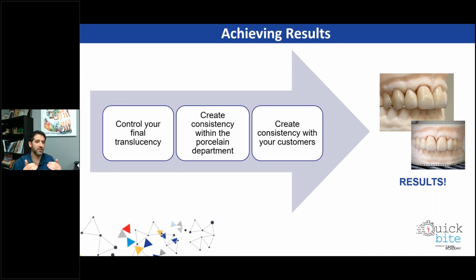So the programs you're going to get from Zahn or from your vendor are going to be the basic right temperatures, but none of our ovens, after working every day for 10, 12 hours, are going to run the same temperatures. So you need to either keep on calibrating your oven or keep on adjusting it to get the right results. So I say get the program from Zahn that actually comes with the material. And you also get little test units with the material to calibrate your oven for it, but then play with it to get your results. You can take your oven a little bit lower temperature, a bit higher temperature to achieve the results you want.